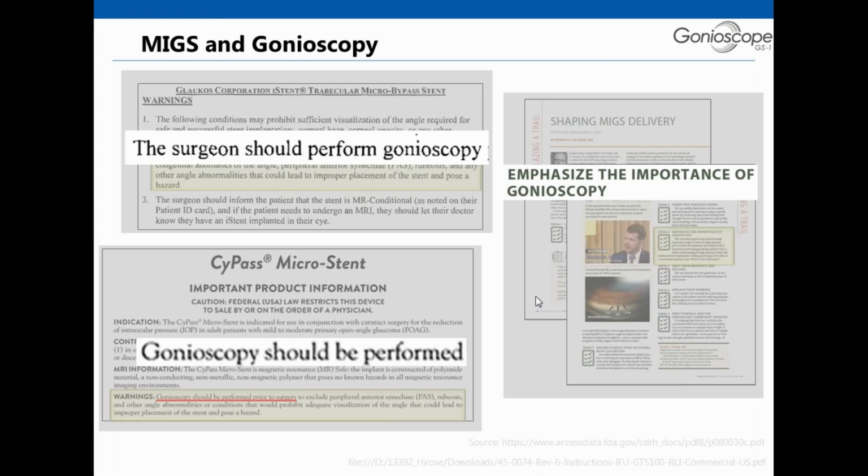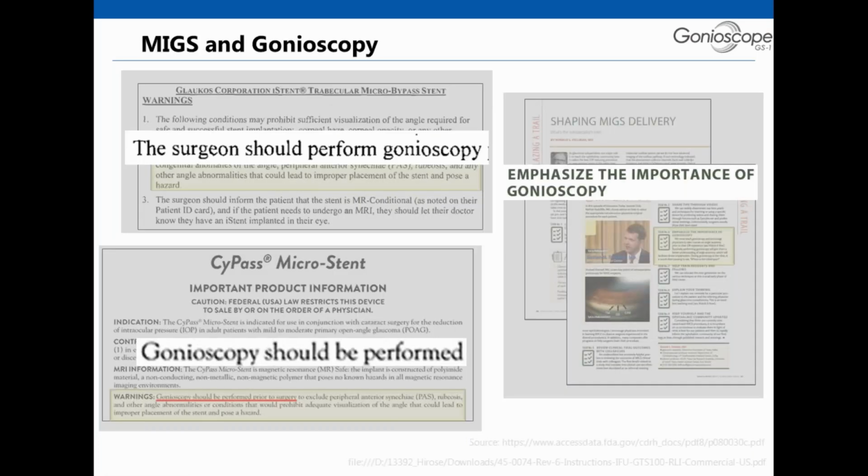So this is also from section 1, which states the surgeon should perform gonioscopy before MIGS. This is from iStent, and the bottom is from Cypass. Gonioscopy should be performed. So what I wanted to emphasize is that there will be a lot of surgeons using MIGS, and whoever does MIGS should perform gonioscopy. So there's a lot of market for us.